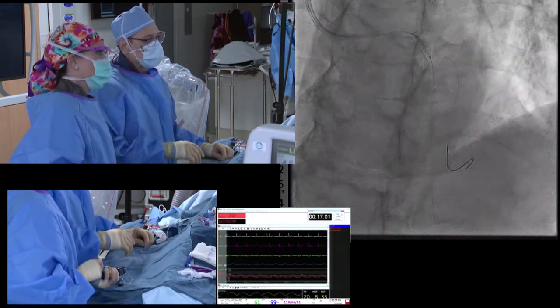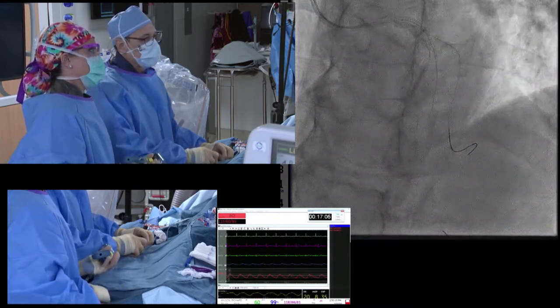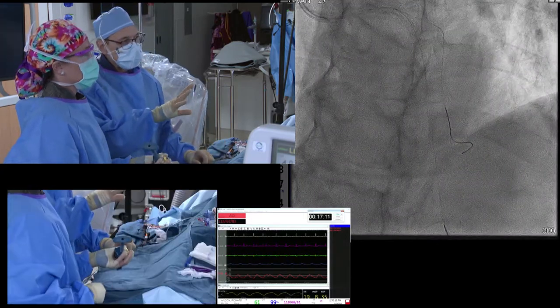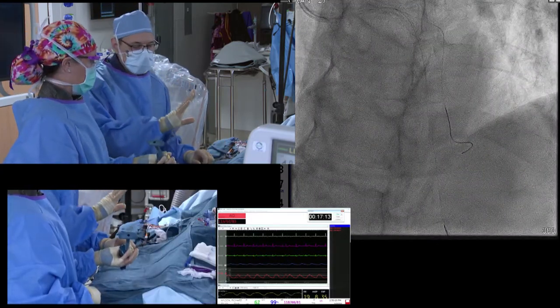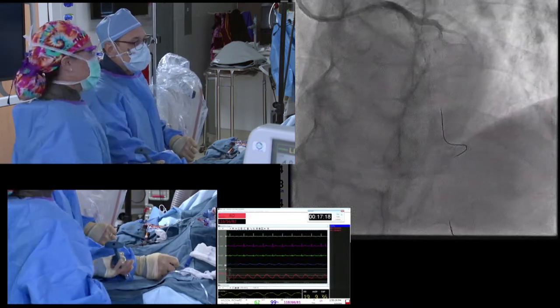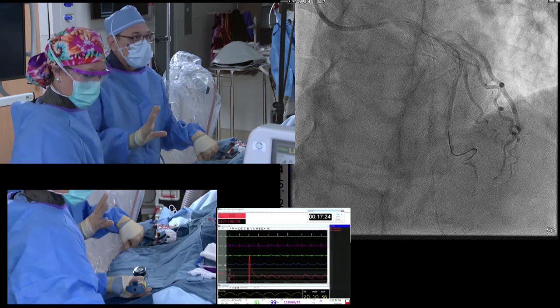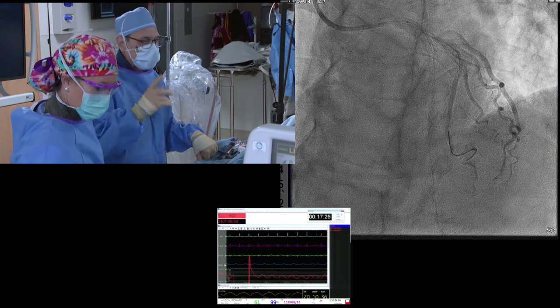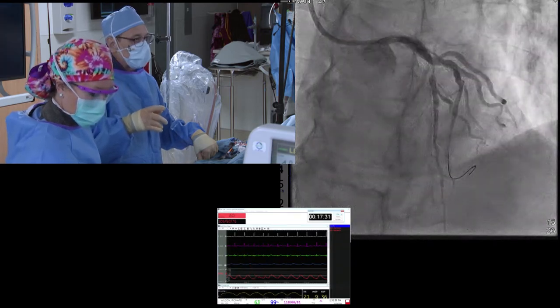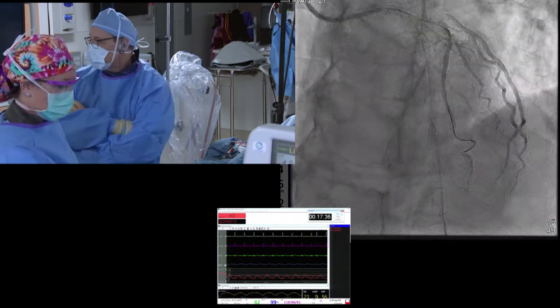Tracy does a lot of cases with me — sometimes she knows what I want to do before I do. I'm going to leave this balloon in place because we had some damping of the pressure waveform, and having the balloon in there helps prevent further damping. Now we have flow — what a tight lesion! Just having the wire down limited flow into the LAD, and just dilating it that much made a big difference.